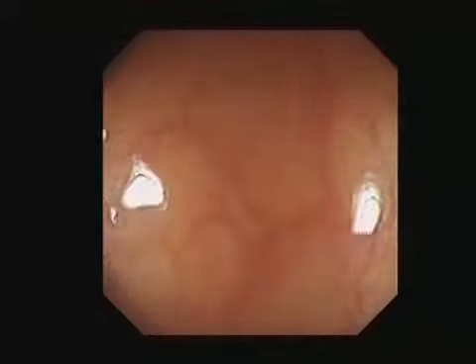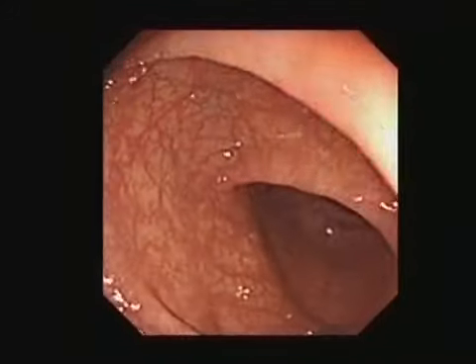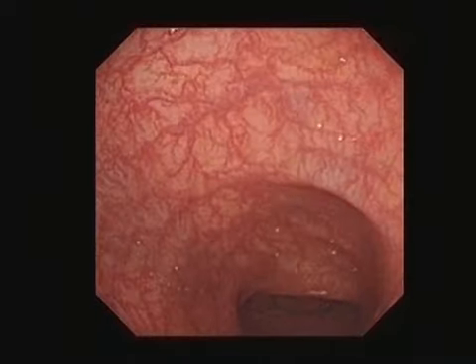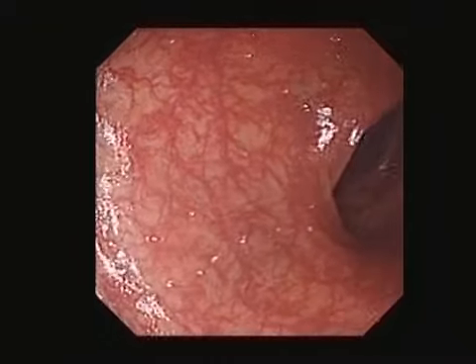Steering carefully and handling the scope properly, tracking through the sigmoid should usually take little time and present no great problem. However, the sigmoid is the most unpredictable part of the colon. Adhesions from previous hysterectomy or diverticulitis can cause fixation and difficulty. A paediatric colonoscope or even a paediatric gastroscope makes things easier.